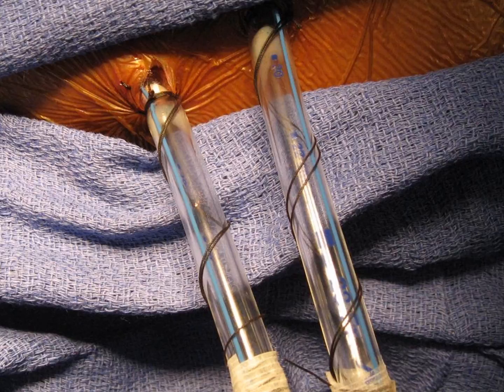Normally, 2 heavy silk sutures are placed before chest tube insertion. One simple suture outside the skin incision, which is tied firmly in order to make a waist on the chest tube, and a second vertical mattress suture in the center of the skin incision, to be tied after the chest tube has been removed.